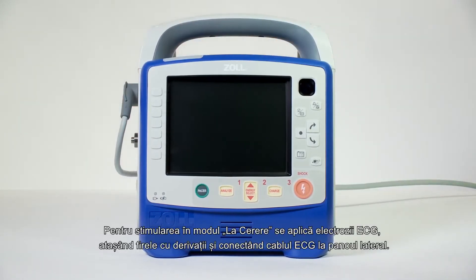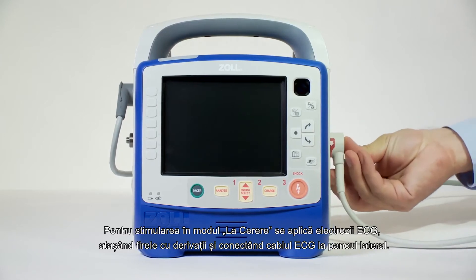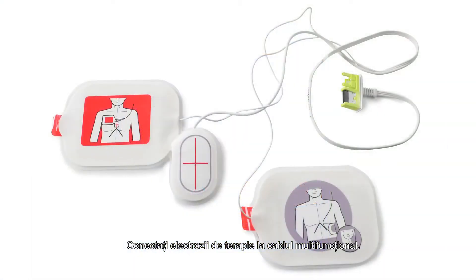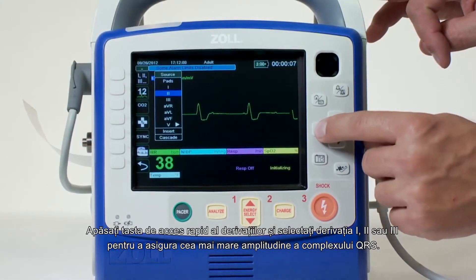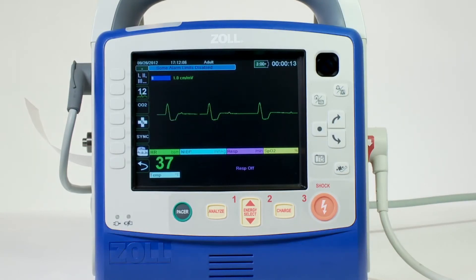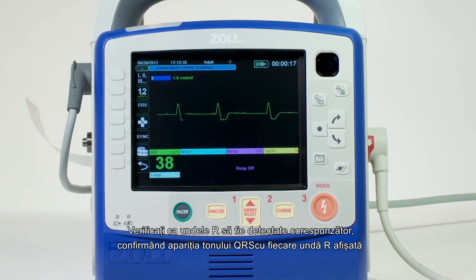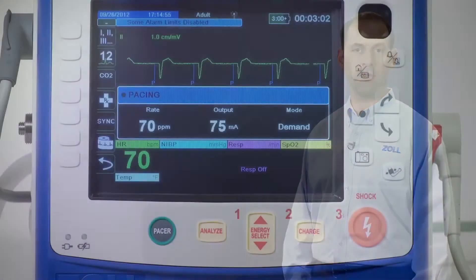To pace in demand mode, apply ECG electrodes, attach lead wires, and connect the ECG cable to the side panel. Connect the therapy electrodes to the multifunction cable. Press the lead quick access key and select leads one, two, or three to provide the largest amplitude QRS complex. Verify that R waves are being properly detected by confirming that a QRS tone occurs with each displayed R wave, or by verifying that the heart rate display accurately reflects the patient's pulse rate.